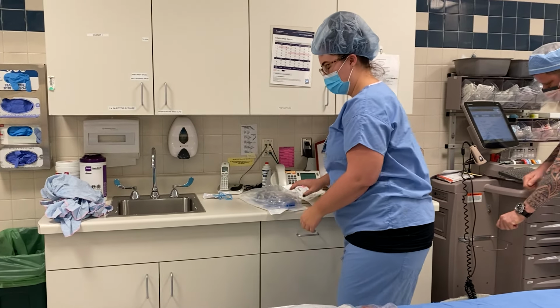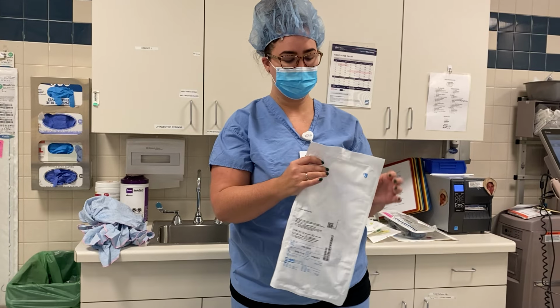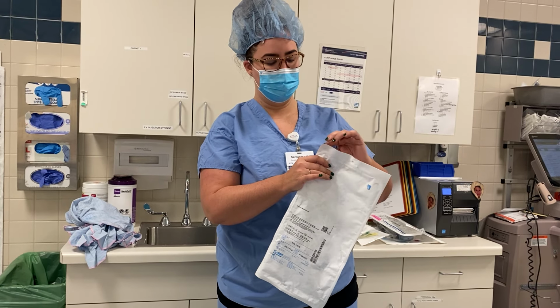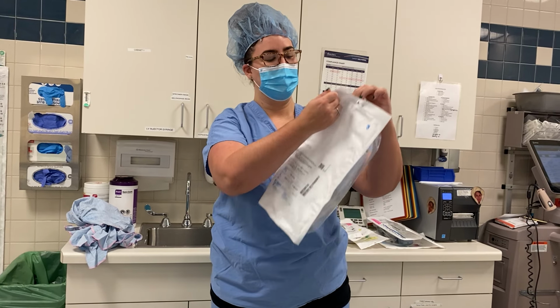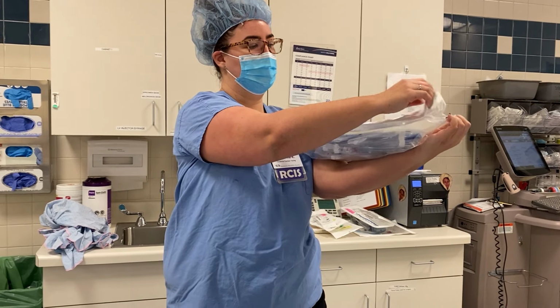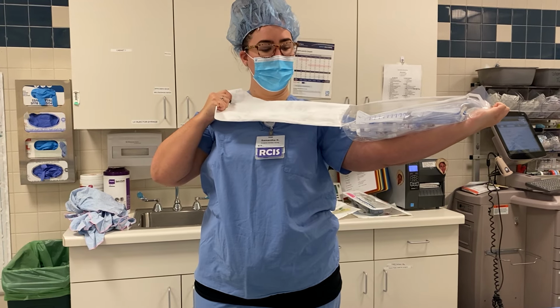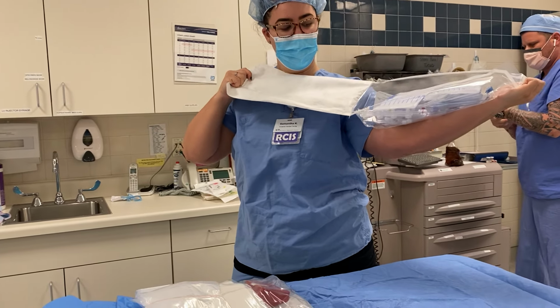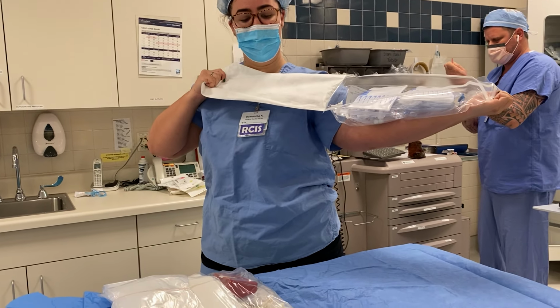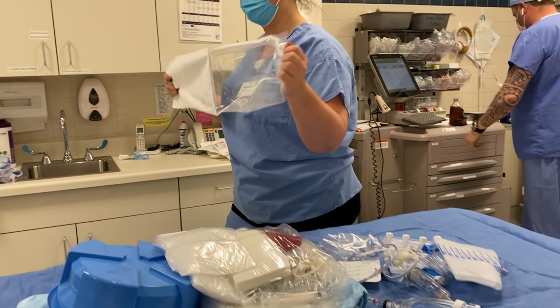The next thing that we're going to open is our manifold pack. The best way to open this is to rest it right on top of your arm and pull the package back completely. And then while holding everything securely, I'm just gonna turn and dump. Just like that.